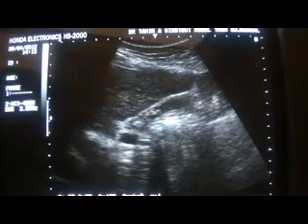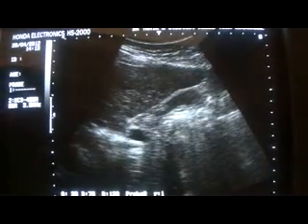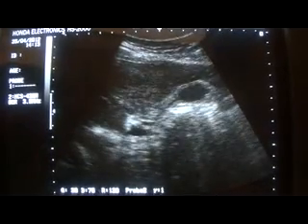This video relates to the complaint of a patient with pain in the right hypochondrium for a couple of months with nausea, and therefore the effort to evaluate the gallbladder. This is the gallbladder in front of you, with the portal vein at right angles to its neck. This is a contracted post-prandial gallbladder.